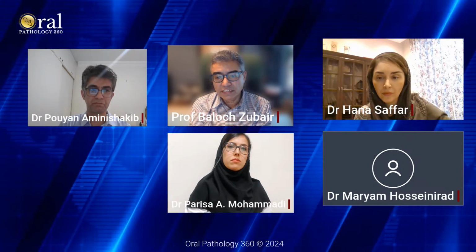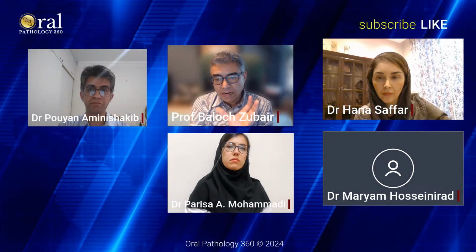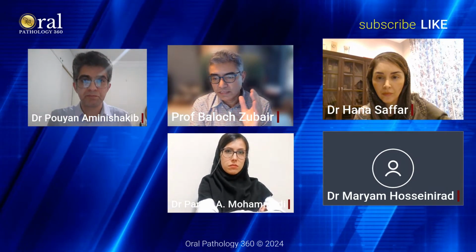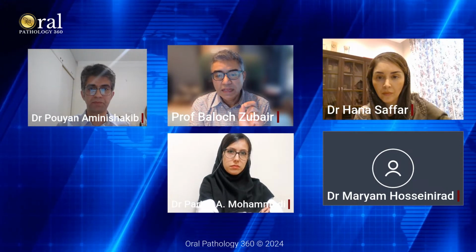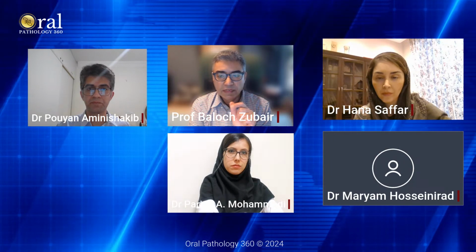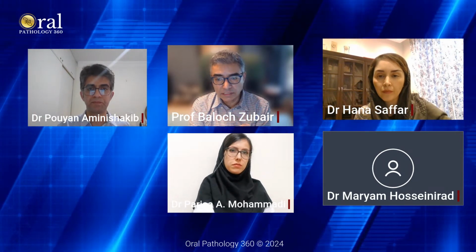Now, in the minor salivary glands, there is more heterogeneity, right? Because there is a lot of overlap. But what one has to think about when you're looking at a biopsy is to create what I call food groups. So you have to have this checklist. Is this a basaloid tumor? If it's a basaloid tumor, is it a monomorphic basaloid tumor? Because as we know with adenoid cystic carcinoma, there's not much nuclear pleomorphism, right? They all look the same in a classic case, unless it's a high grade one with a solid growth pattern.